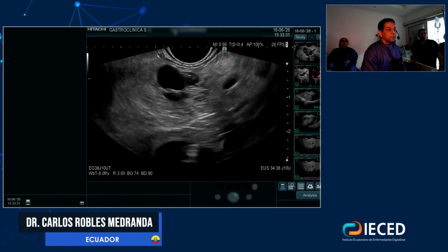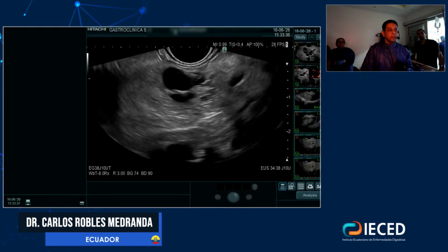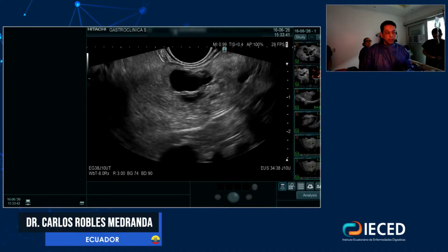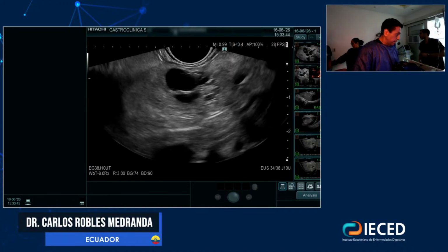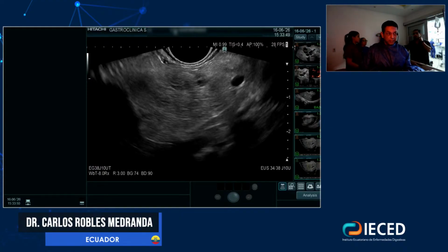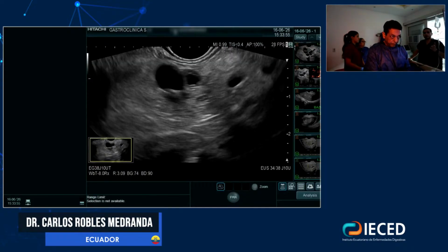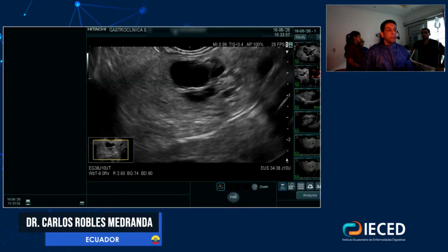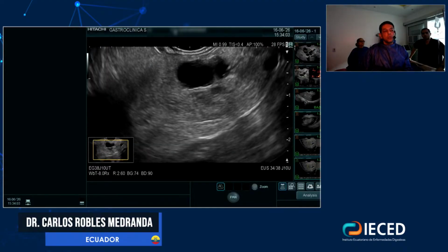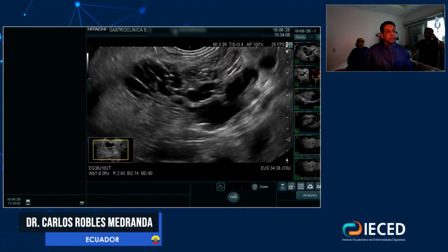the Murray biopsy forceps. So it's very controversial in terms of the risk of complications, but in the largest series published, I think there is one fatality, one patient that had a complication, but I believe it's also the technique, and also where we take the biopsy. So now I will take from this area, and then I will change to a 22 gauge needle to take from this area, where I see a lot of microvascularization, right?